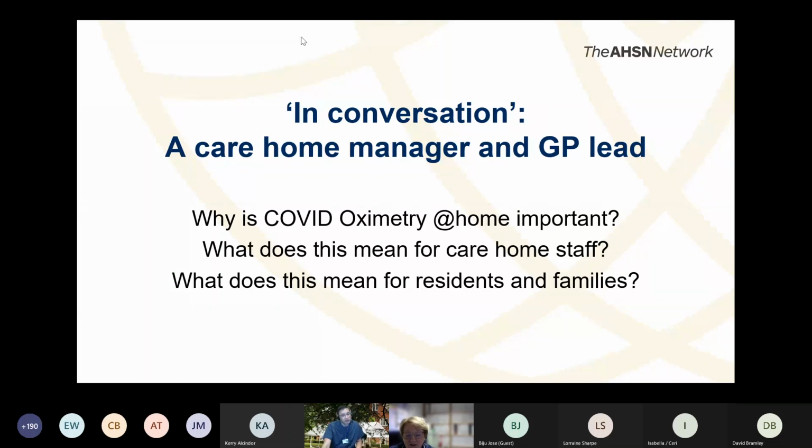And I think the need to be so vigilant on the observations visually, but also using the oximetry, and especially with COVID, that it's a key indicator and an assistance to actually recognising how potentially ill this resident could be or become. And just setting up a red flag that your observations are not just done once. You're going to be doing them 2, 3, 4 times a day until you can actually see either somebody stabilising or deteriorating further and escalating it.